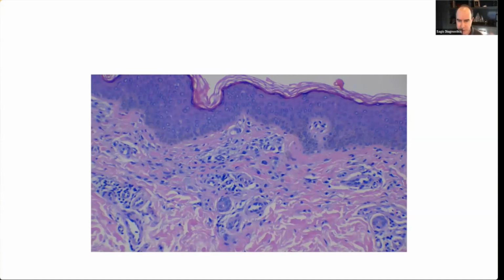but we're going to need to throw on our immunostains to see what these are. So we could throw on CD68 for macrophages. Might want to make sure they're not melanocytes. So we could throw on an S100 and a MART. Might want to throw on a T cell marker and a B cell marker, so CD3 and CD20. And then we would also throw on a mast cell marker, CD117 is what we're going to use for immunostains.